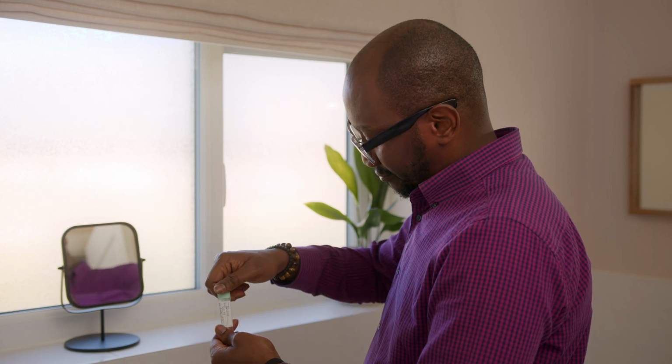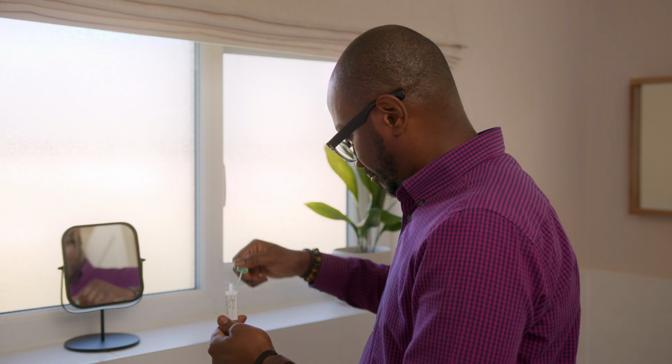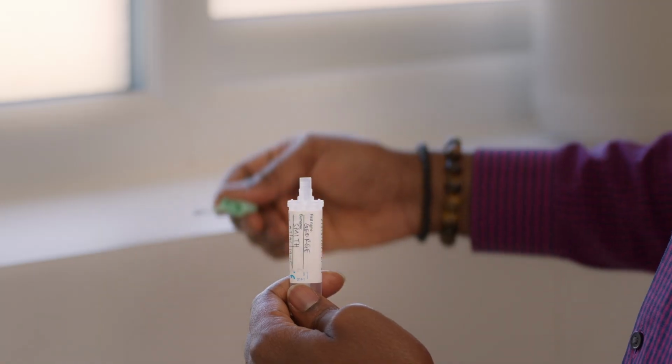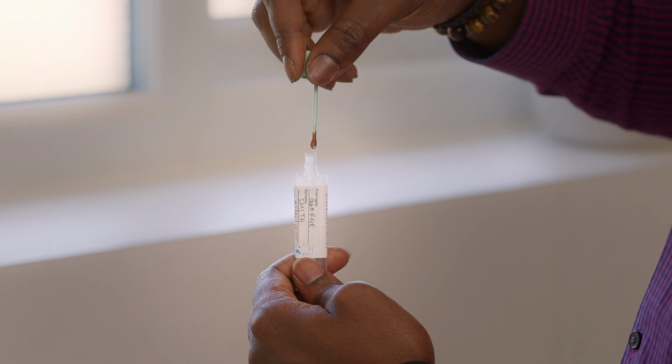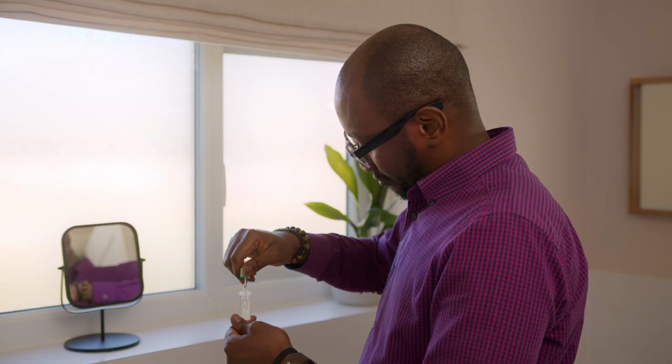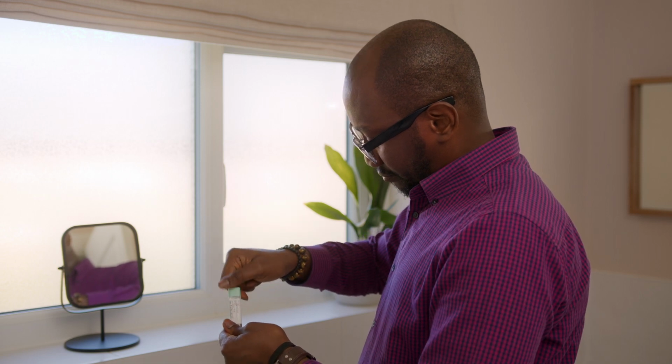Different types of stool kits use different collection tubes. If you've got a green qFIT sample tube, twist the cap off and take care not to spill the liquid inside the tube. You just need to scrape the collection stick across the stool to collect a small amount on the grooves of the stick. You really don't need much at all. Twist the lid back on.